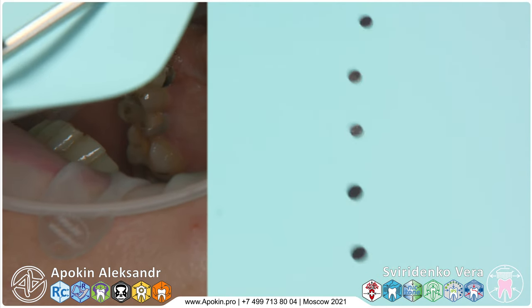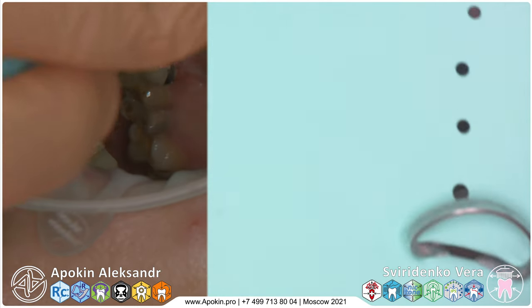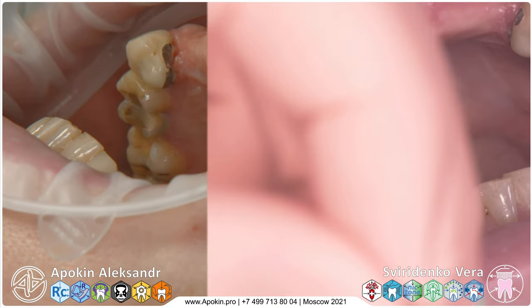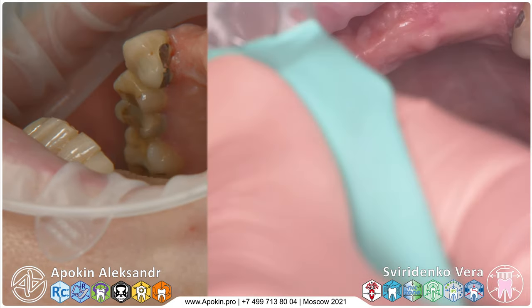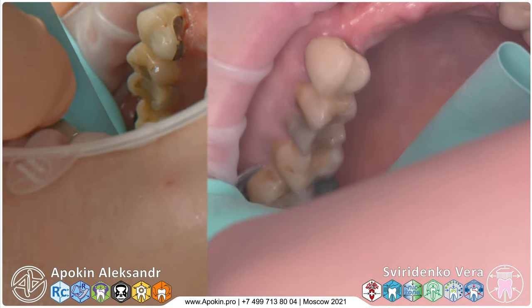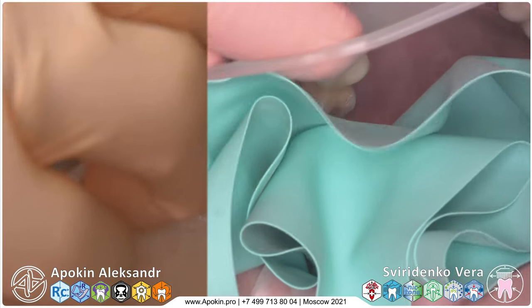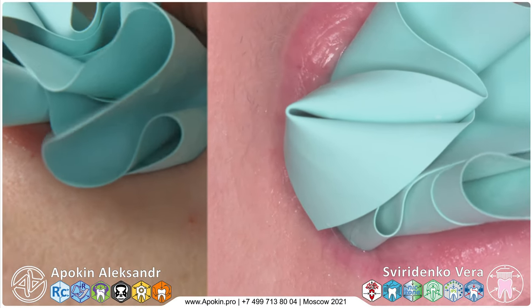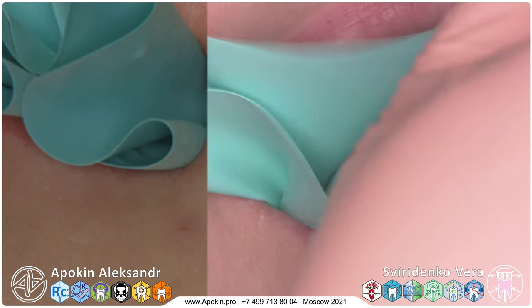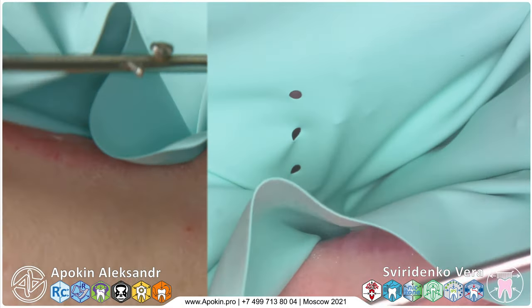We make such perforations and fix the clamp in one of them, this way. This is very easy and very handy for fixation during isolation with the wingless clamps. This is not very hard. Additionally, again, check fixation. Always check with your patient if he or she feels all right, if anesthesia is enough for your treatment. Then we fix our rubber dam plate back to our frame. This is not very hard.